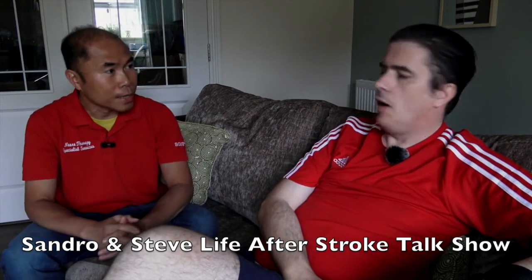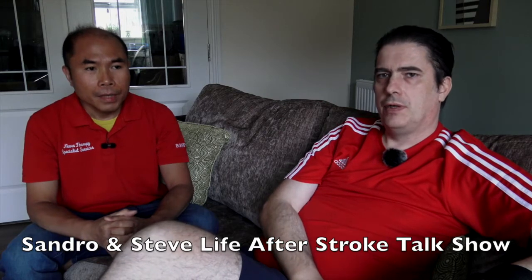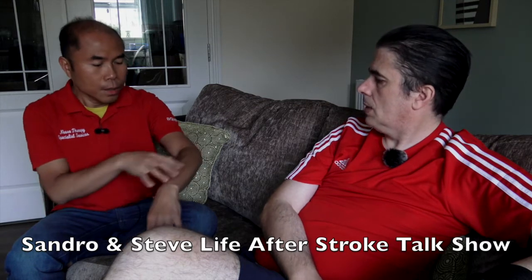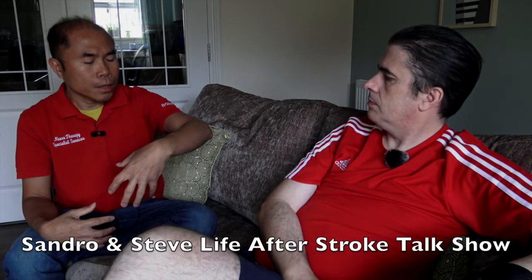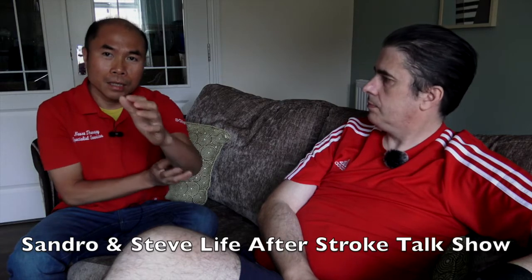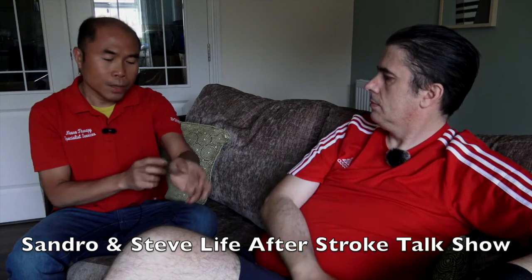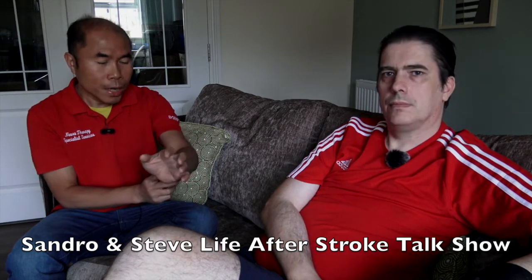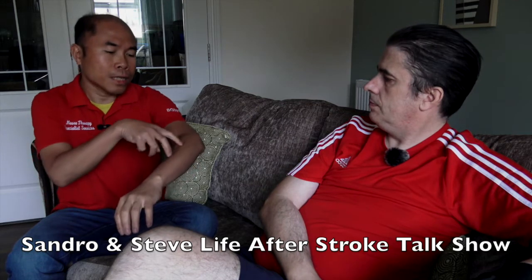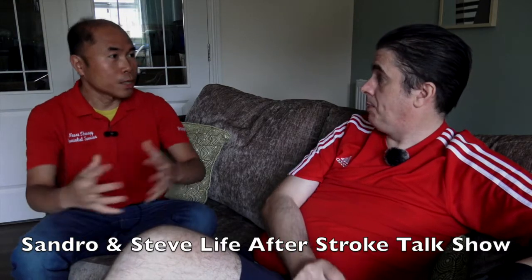I imagine Sabo's is more sophisticated. I was just about to say to you, Sandra, I imagine theirs has been brilliant. So we've tried their glove and their other stuff. Theirs is not only electric muscle stimulator but also reciprocal inhibition. A lot of the problem of stroke patients is not only being able to contract the muscle, but also the opposite muscle is hypertonic, with increased tone, so increased spasticity on the opposite side. So what this Sabo stimulator will do is allow the patient to understand the behavior of the opposing muscle group which causes the problem, and try to inhibit that, at the same time contracting the weaker muscle group so that the wrist extension, or whatever movement they're trying to achieve, can be done.